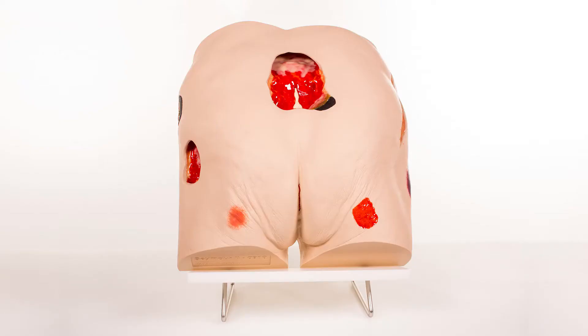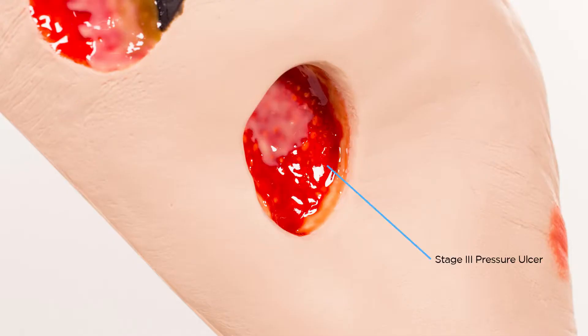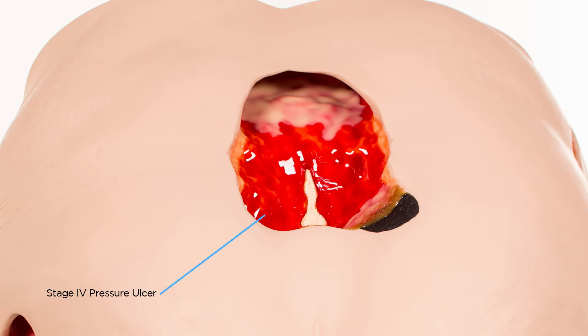On the left side you have a stage I. On the right side you have a stage II. Stage III is on the left side of the model, with a small amount of undermining and tunneling, and a large stage IV on the coccyx, displayed with some eschar on the edge and slough traveling down into the wound.